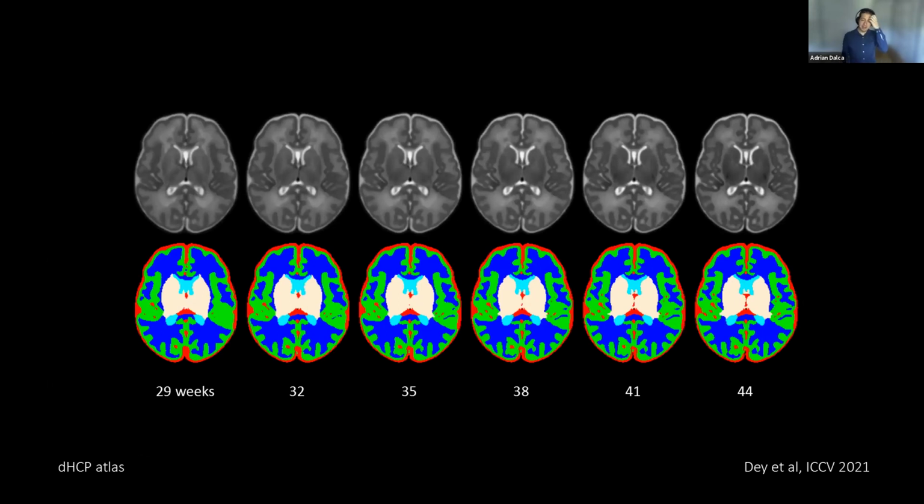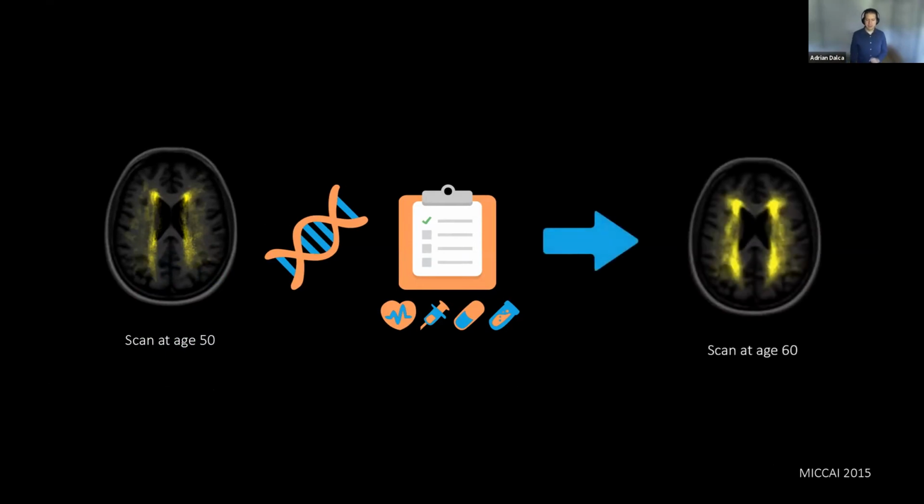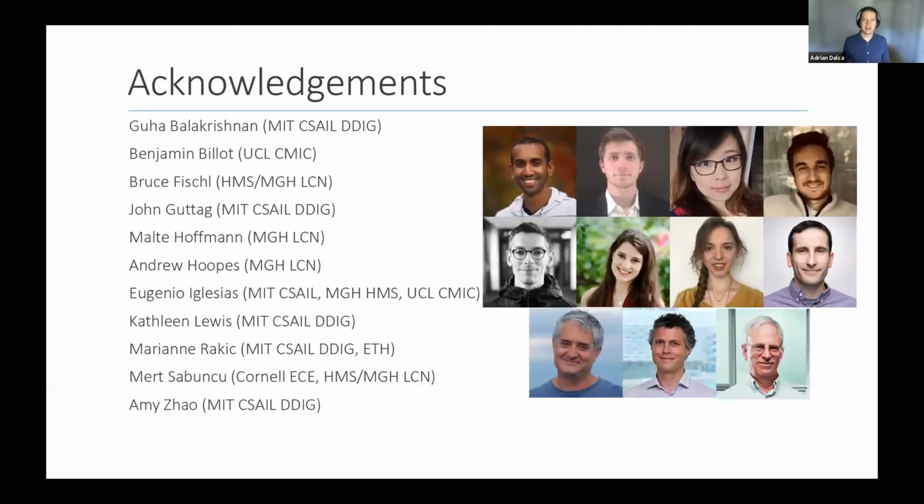And I'm very excited to apply these methods, and we have ongoing projects on going back to those original projects. Can we build atlases of change? Can we build atlases that show how a brain will grow in young patients, how a brain will atrophy in older patients? So atrophy maps or disease change maps, how white matter disease spreads through a patient as a function of attributes we care about, as a function of someone's diagnosis and sex and so on.